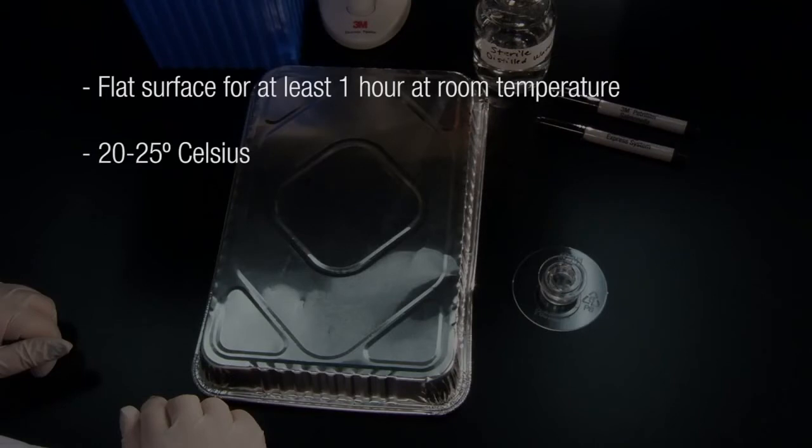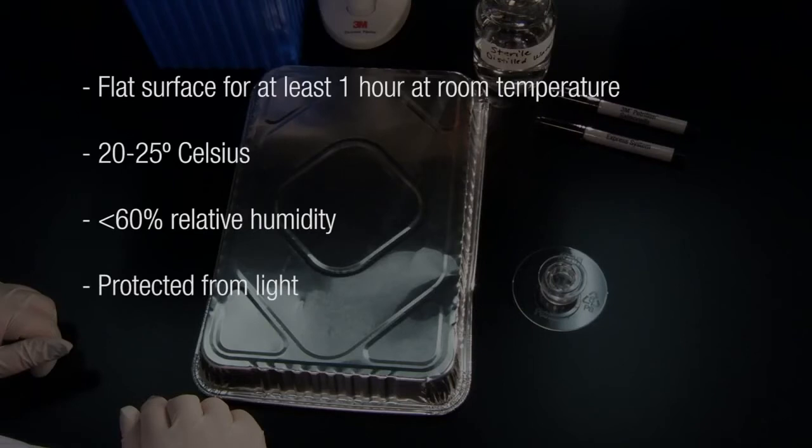Place the 3M Petrifilm Salmonella express plate on a flat surface for at least one hour at room temperature, 20 to 25 degrees Celsius and less than 60% relative humidity, protected from light to allow the gel to form. An aluminum foil tray is being used here.